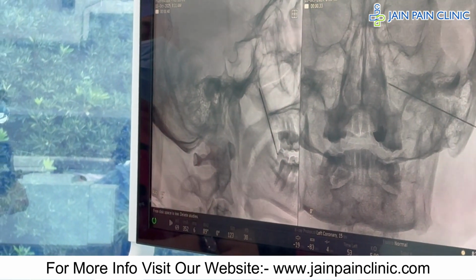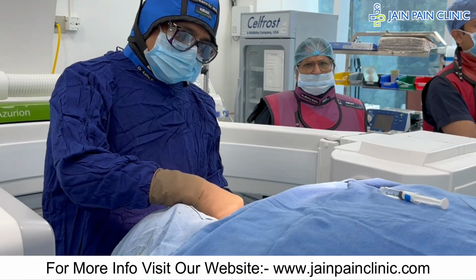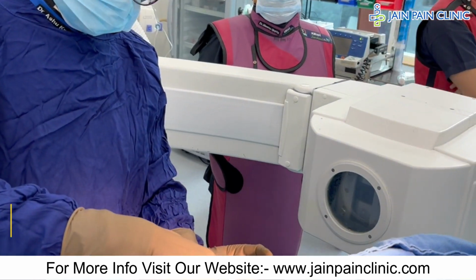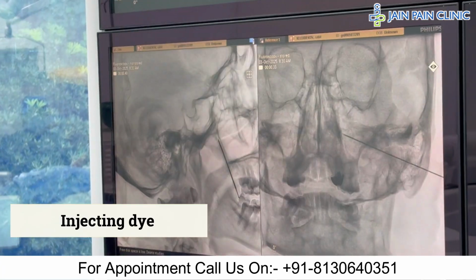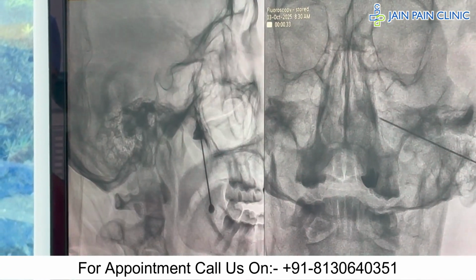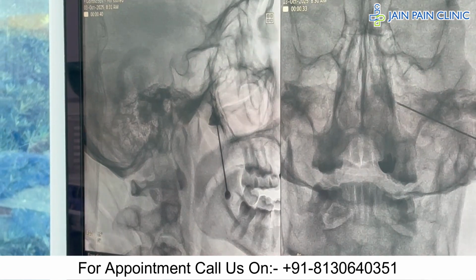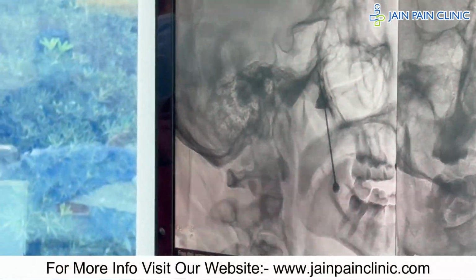Now we will inject the dye and see the spread of the dye. So the dye is inside also, right? Yes. And coming out also. Let us see in AP view.